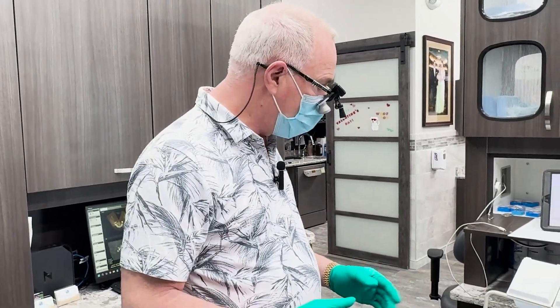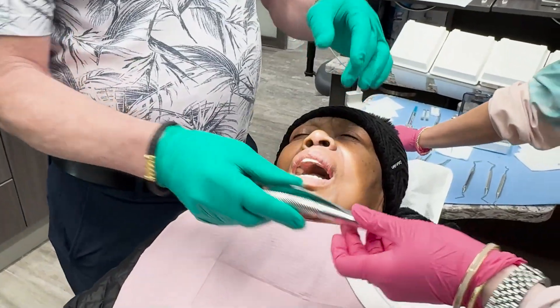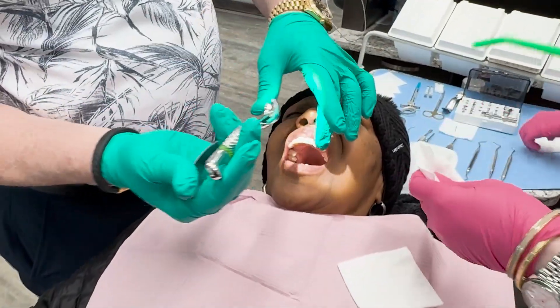Is she numb yet? Okay, you're all numb? All right, we're going to go ahead and take that out, okay Marie?